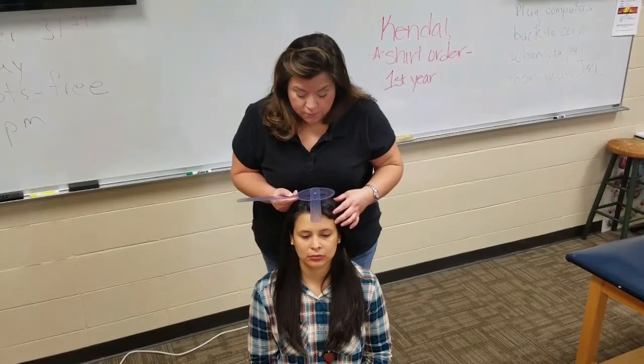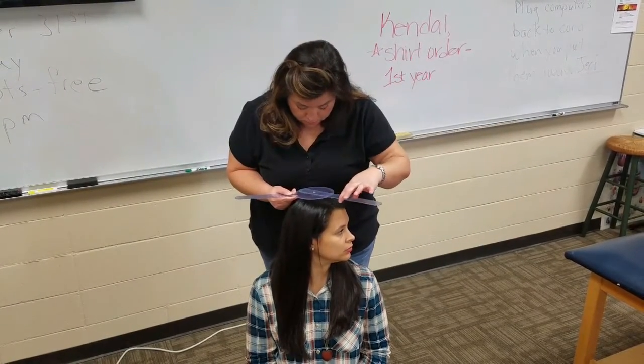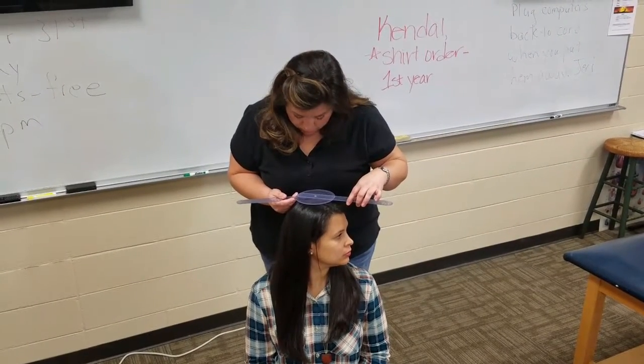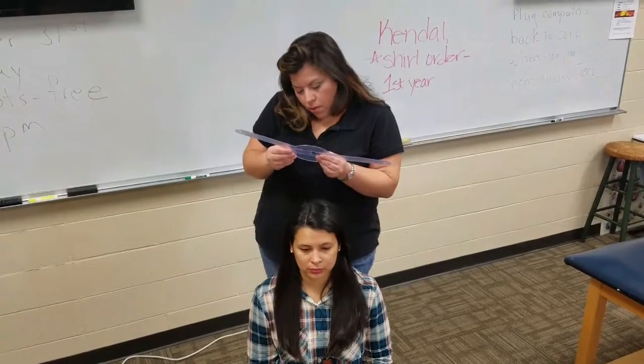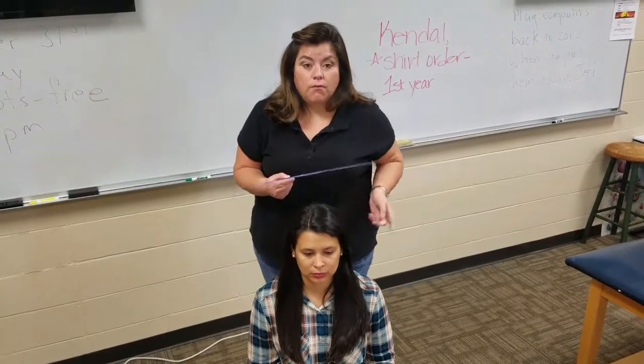So what I'm going to have her do is rotate her head to her left. Can you go ahead and do that for me, please? Now I'm going to realign the goniometer. All right, so for this motion, I have, go ahead, you can go back, 67 degrees of left cervical rotation.